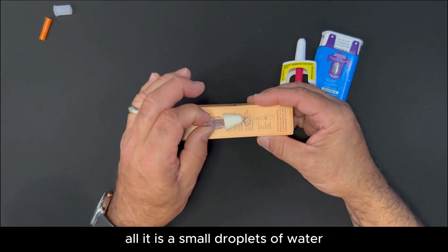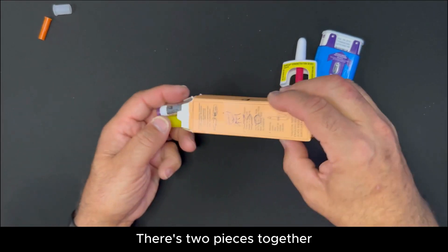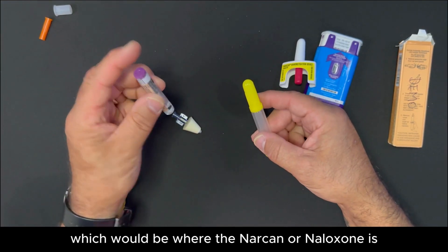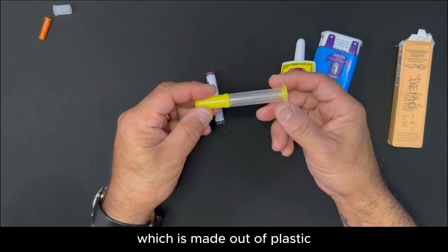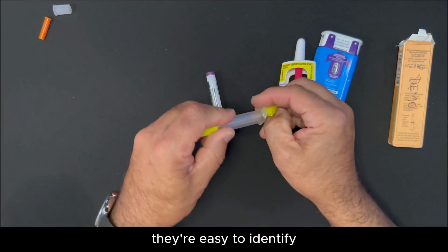The mist is just small droplets of water. There are two pieces together: one is glass, which is where the Narcan or Naloxone is, and this delivery system, which is made out of plastic. The two bright yellow pieces — you're going to pop them off. They're easy to identify.